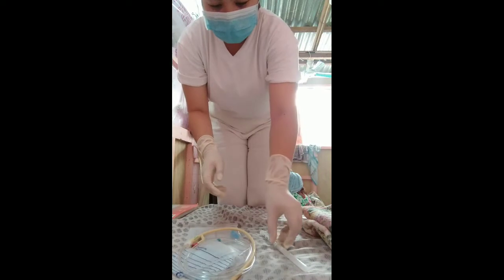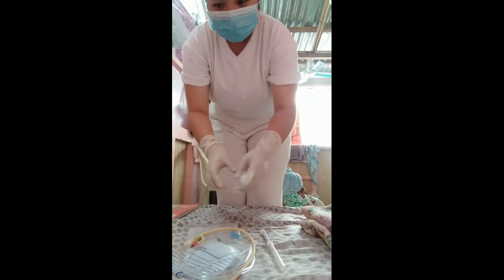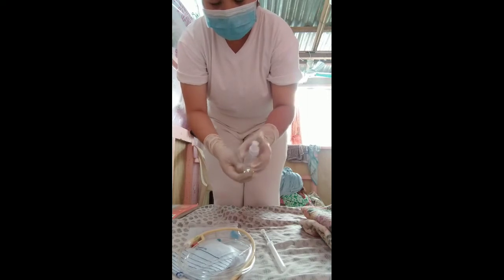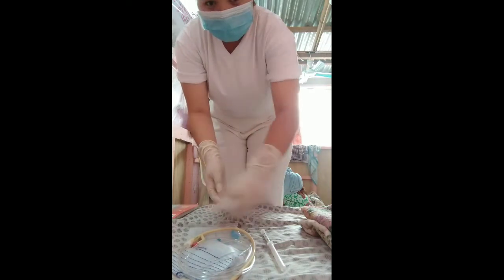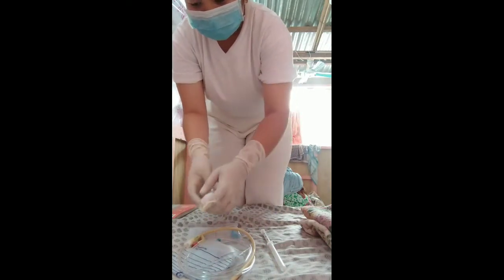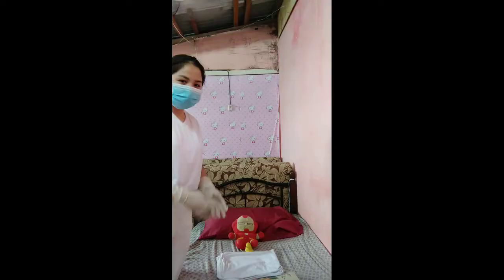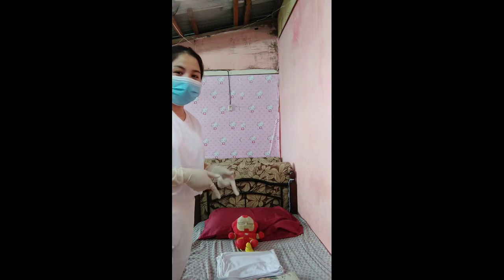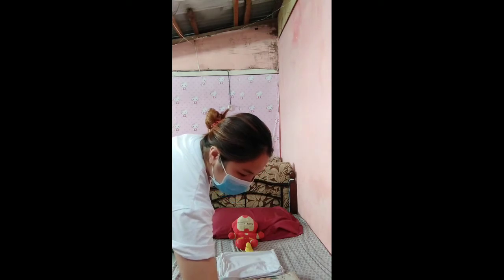After attaching the 10 cc syringe with water to the port of the catheter, we need to lubricate it. So we assume that this is the lubrication for the catheter. We need to put lubrication before inserting the catheter into the urethra. So done. We proceed to the next procedure. After attaching and lubricating the catheter, we need to perform hygiene for the meatus of the patient.